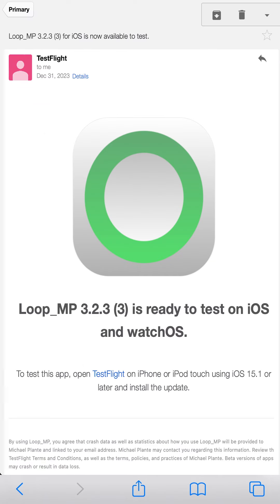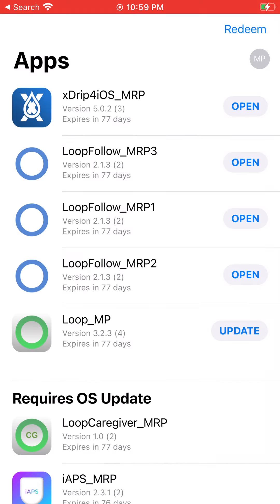You can also look out for an email from Apple Developer saying it's available. Once it is, you can open the TestFlight app, tap Update, and once it finishes loading, you're done. This build should be good for the next 90 days, so repeat the process before then.